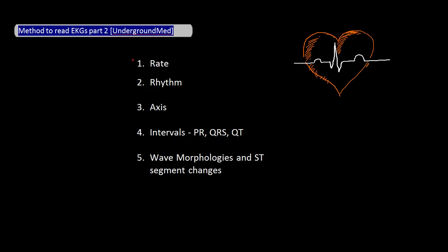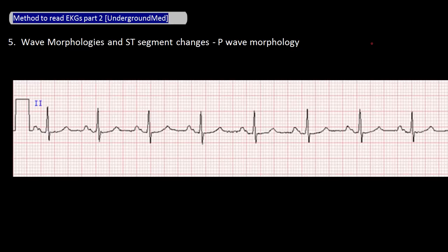In the last video, we talked about rate, rhythm, axis, and intervals. The last thing I do is check the morphologies of each of the waves and check for ST changes. Let's begin by looking at the morphologies of the P waves. Look to see if the P wave morphology within a lead and PR intervals in general are consistent. When looking at P wave morphology, also look at the PR intervals to see if they are depressed. Depressed PR intervals in all or nearly all leads is a sign of pericarditis. You can see here that the PR intervals are not depressed, but are at the same baseline as the rest of the EKG.